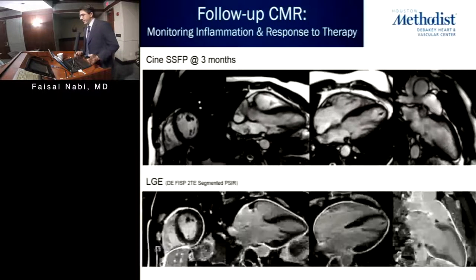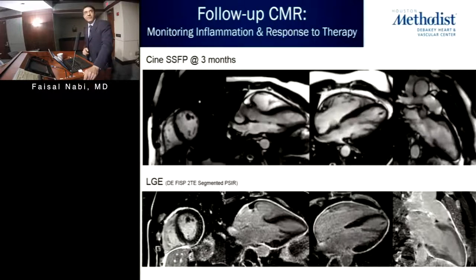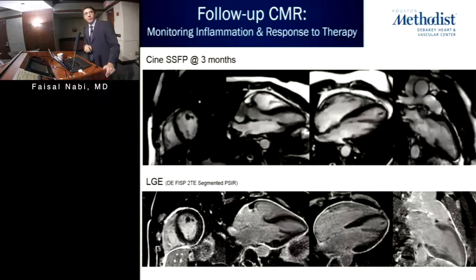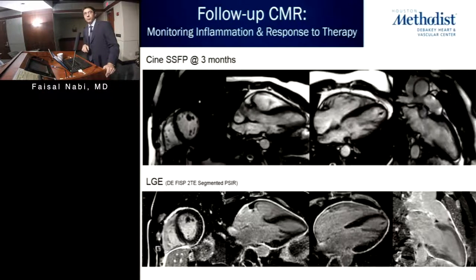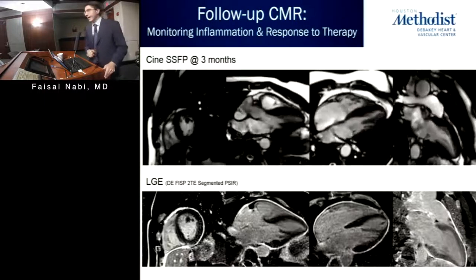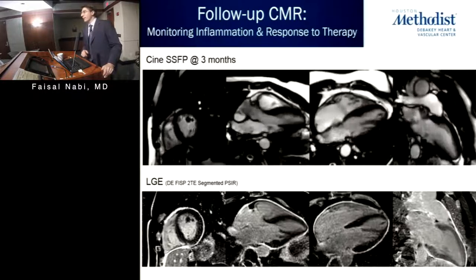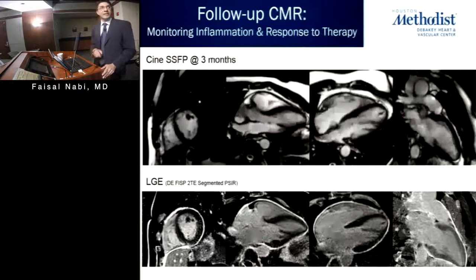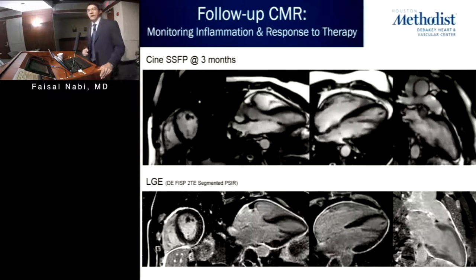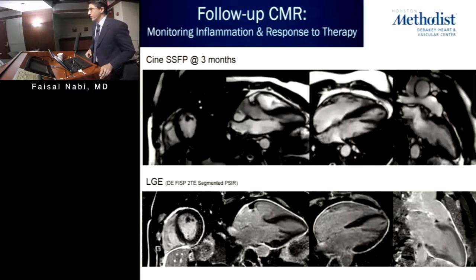However, what was interesting, despite 3 months of treatment with antibiotics and anti-inflammatories, if you looked at his late gadolinium enhancement images, I hope you'll appreciate there was still significant pericardial inflammation present. In this particular case, despite the fact that they were now done with antibiotics, they did continue to treat this patient further with anti-inflammatories to try to get control of the inflammatory process they were seeing.